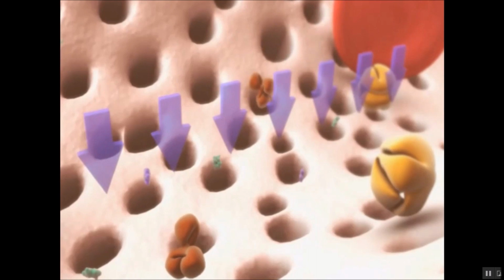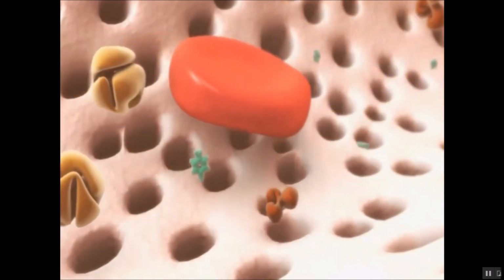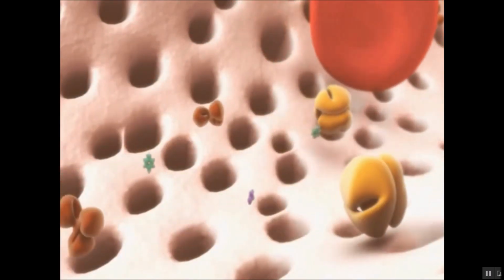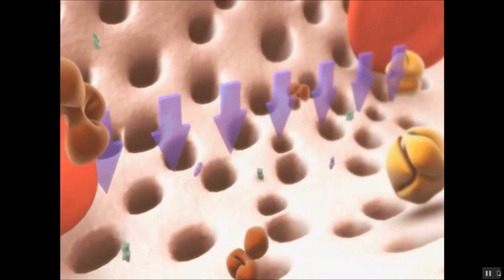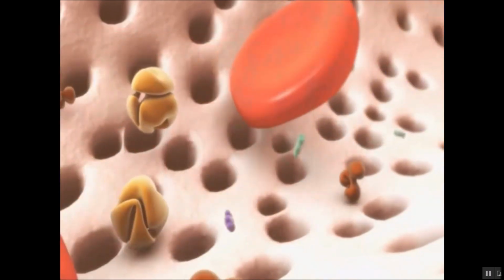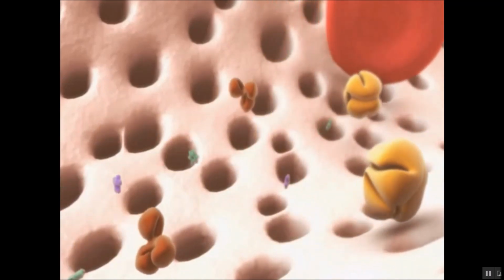In the conventional high flux membranes, the beta-2 microglobulin molecule could be removed easily, while superflux, or what's called expanded hemodialysis membrane, can remove bigger molecules, but unfortunately albumin will be lost as well.